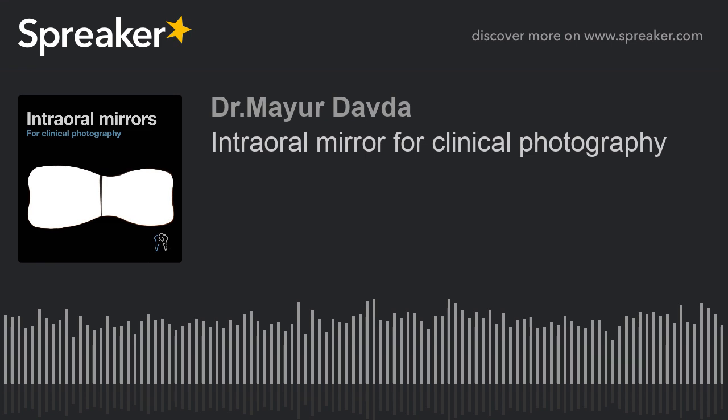This sectional mirror is also useful to record intraoral lesions. So if you're a dermatologist and you want to record intraoral pictures of lesions, but that particular lesion is quite distal, you need to have one of these mirrors because it's a very, very helpful mirror. So try to record a mirror image if you're not getting a good direct shot. Hopefully this session would be helpful for you to make the right choice of mirrors for your intraoral photography and documentation.